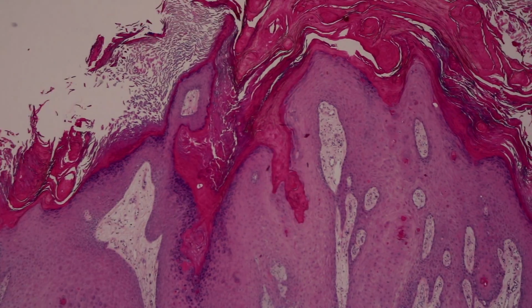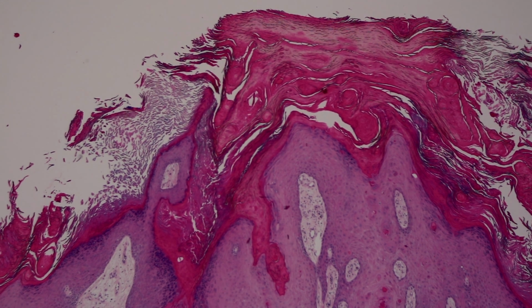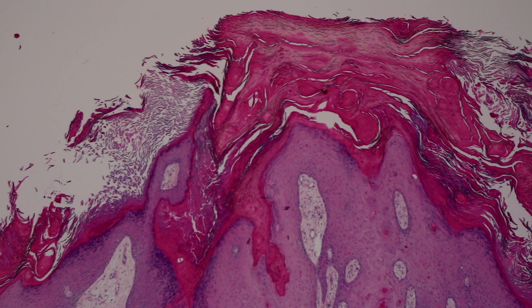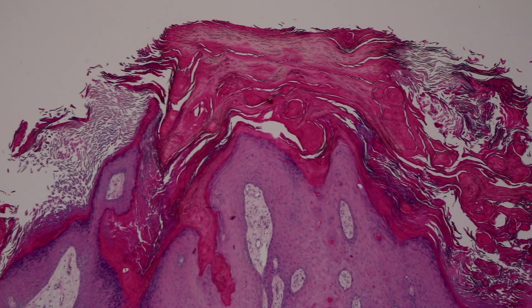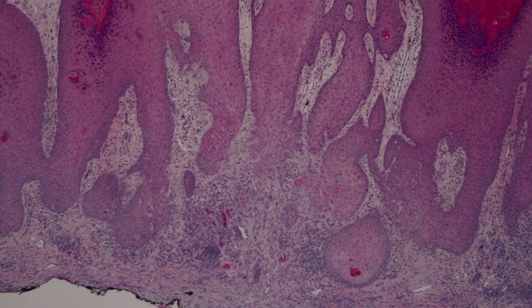So sometimes what I'll do is, if I see something transected like this, I might say, oh, this could be a verruca, but there's a little atypia, and I'm not sure if that's reactive or if there's something worse underneath, and if it continues to grow or if there's clinical concern, then please either rebiopsy or excise it. Sometimes I see things that look perfect like a wart and have no atypia, but again, they're transected at the base and it's an old sun-damaged person, and I'll make a comment that I don't see any atypia, but I can't see the base of the lesion, and so I'm just really wary about diagnosing a verruca when it's transected in chronically sun-damaged skin, because I see this, again, multiple times daily.